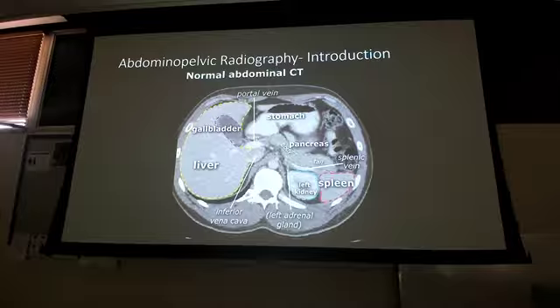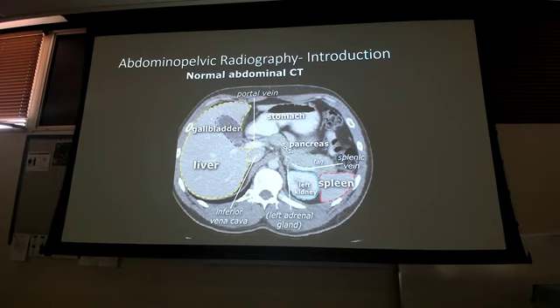This patient does have a right kidney. Why can't I see it? It's sitting underneath the liver, right? So the kidneys kind of sit like that. The liver will push that right one down a little bit.